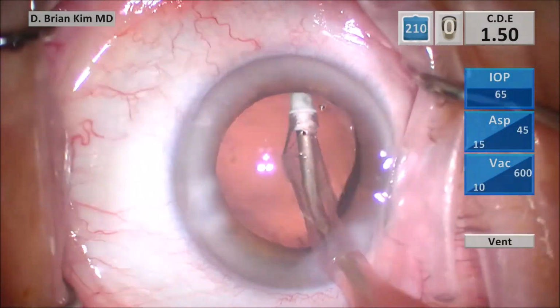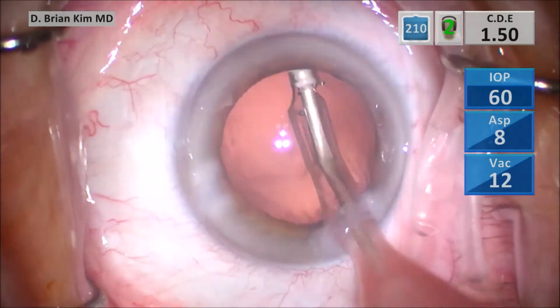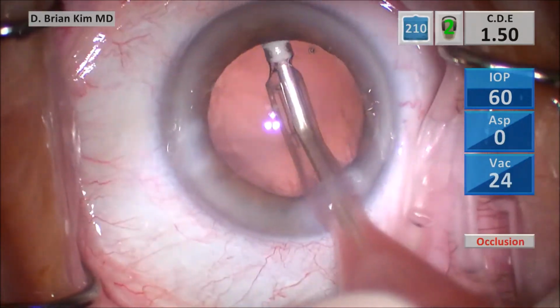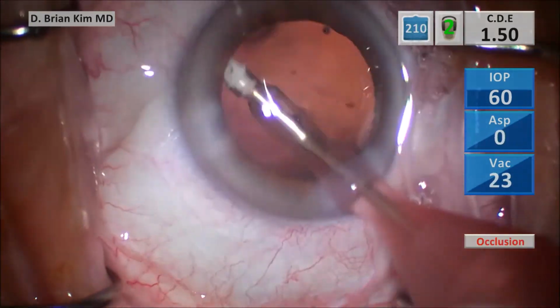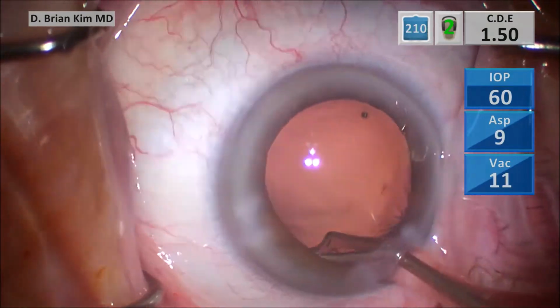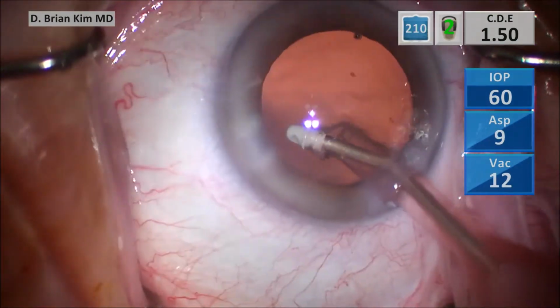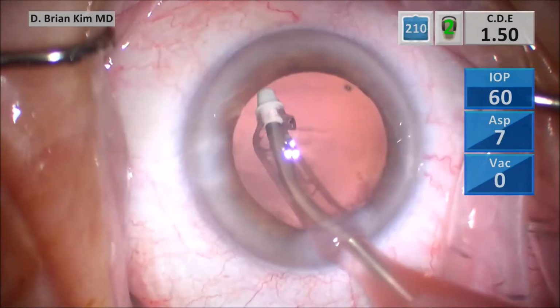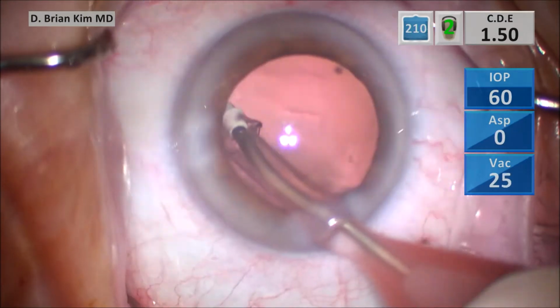Switch to polish mode, polishing under the rhexis edge, removing any lens epithelial cells, but also in the process, sometimes you can snag some hidden cortical material. Again, I like the polish mode because it's very safe whenever you're going deep into the capsular bag there. Polishing on the posterior capsule as well, just to make sure there's no remnants there.